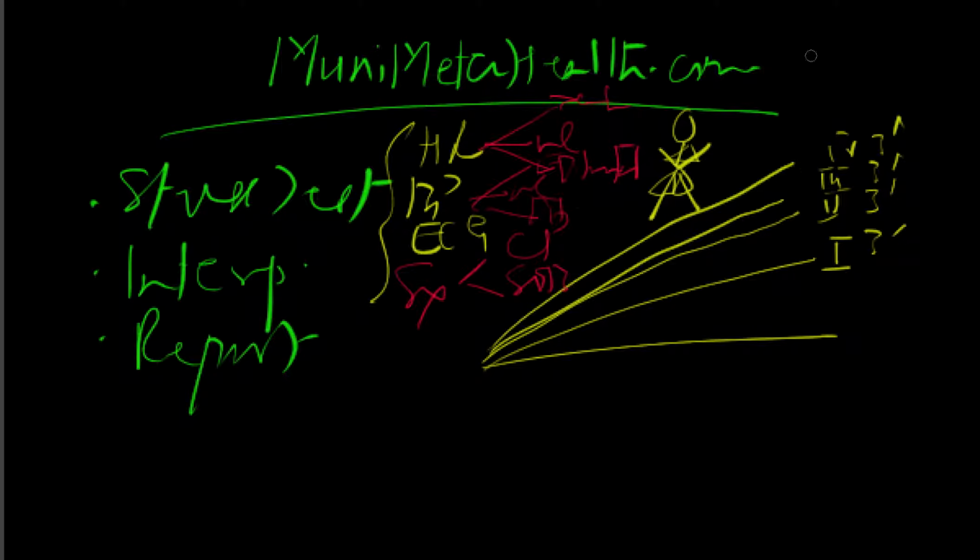Remember, when this person is exercising, you have this monitor hooked up with all the EKGs going into the monitor, and then you have all these leads attached to the person. So you're checking the heart rate, you're checking the blood pressure every 2-3 minutes, at least once per stage, maybe more often. And then, of course, the ECG monitoring is continuously being done. Why do you do the ECGs? Well, obviously, you want to know the ST changes that may develop in any of the 12 leads. Then you want to see also if there's an arrhythmia that's developing.